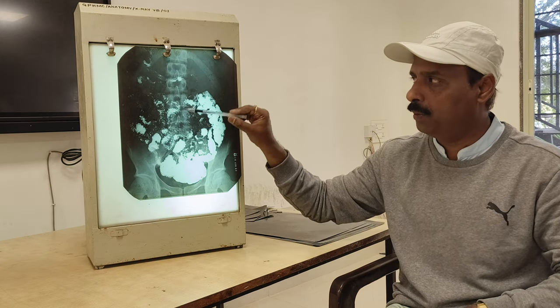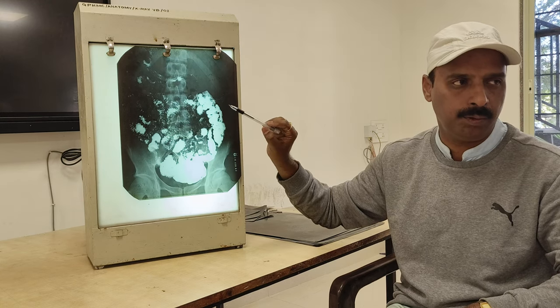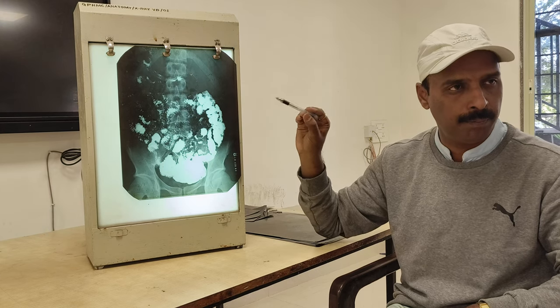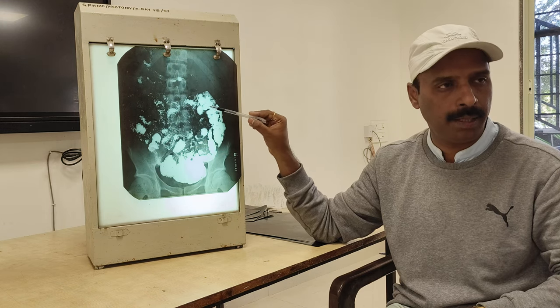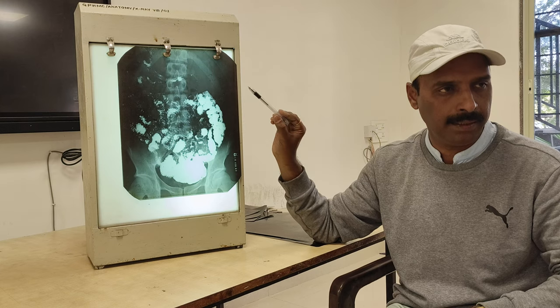Okay, that is one you can see, and this is all the parts of the large intestine you have to mention here. And this is an x-ray of barium enema, and it is done to diagnose diseases of the distal part of the intestine.